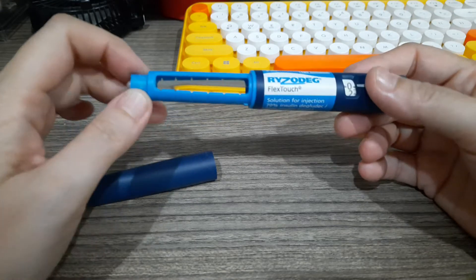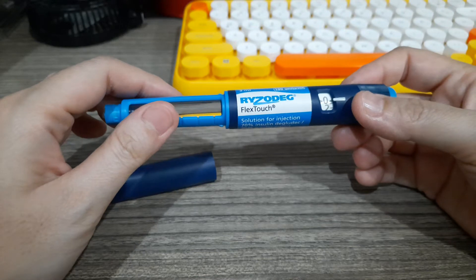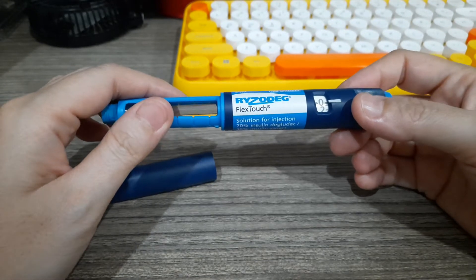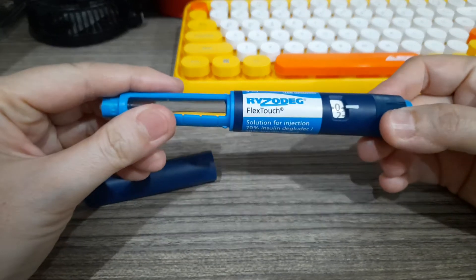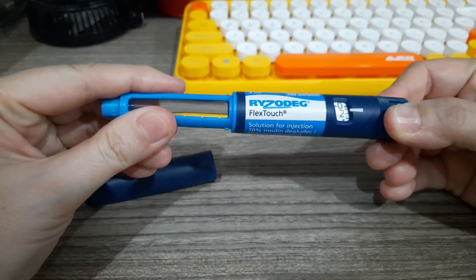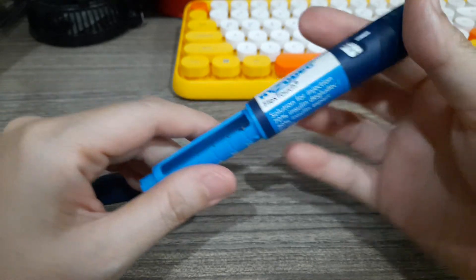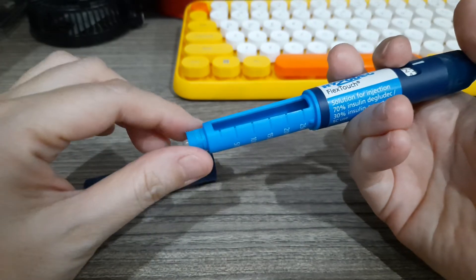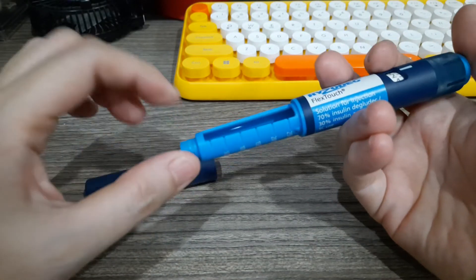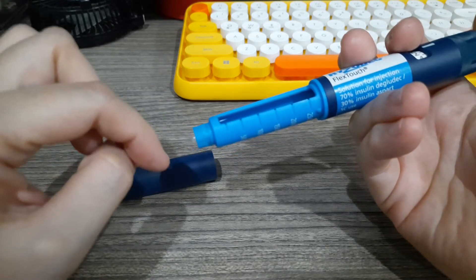Let's say your physician prescribes you 20 units at breakfast. What you do is attach the needle first, then dispense two units — one, two. One click is equivalent to one unit. Dispose of those two units. There's no needle now because this is just a demo pen, but once the needle is there you will see a tiny dot of insulin.